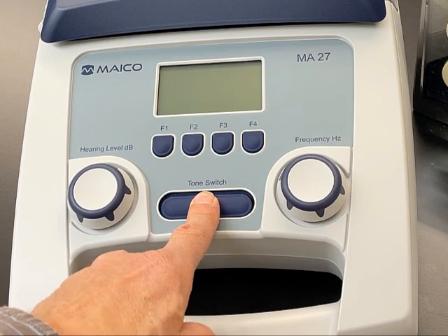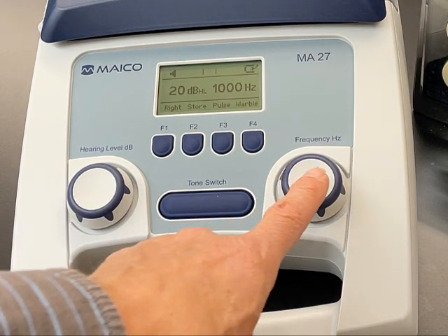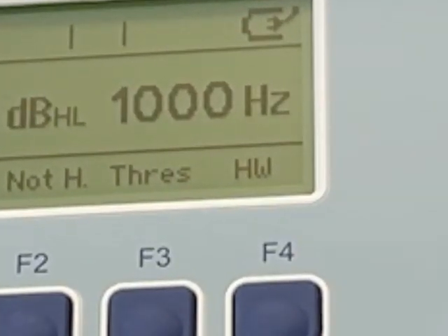Press the tone switch to power on the audiometer. Press the frequency knob down. HW should show on the bottom right of the display.